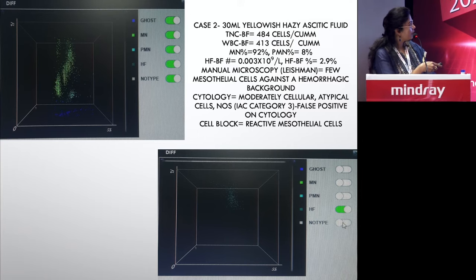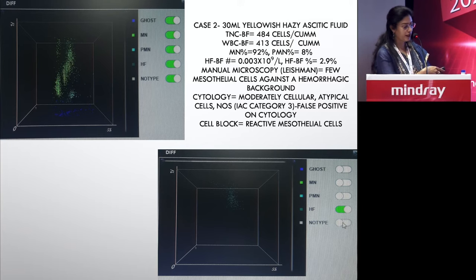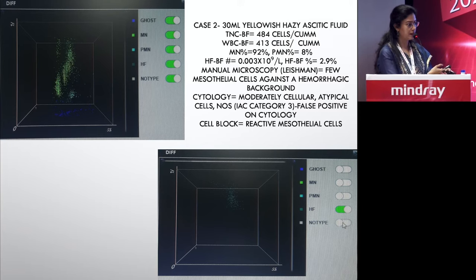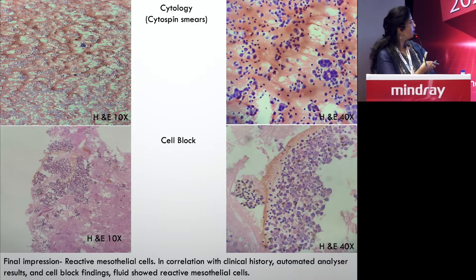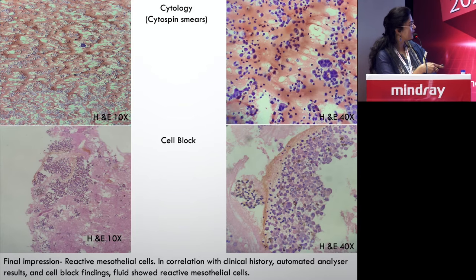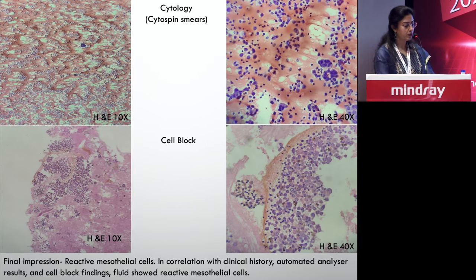On manual microscopy, cells were predominantly mesothelial. On cytology, there were a few atypical cells, but this was likely a false positive because the cell block proved they were reactive mesothelial cells. The cytospin showed reactive mesothelial proliferation, and the cell block confirmed only mesothelial cells. On cytospin, the cells were initially thought to be malignant, but the cell block and IHC proved it was benign.